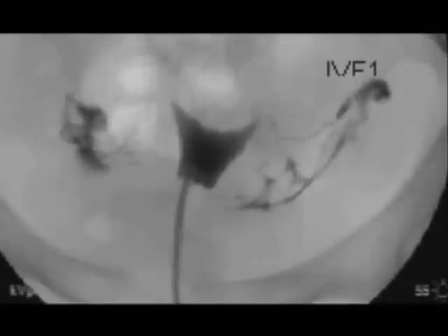If there is a blockage, the agent will stop at the point of the blockage, enabling the physician to identify it.